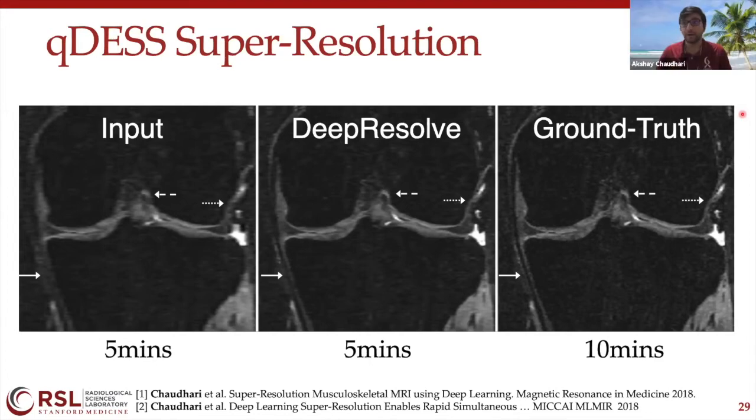Yeah, so I think when we train these algorithms, we try to account for some of these differences too. During our training, we can actually augment our training data set by creating new data that might be motion corrupted, because we understand the MRI physics interpretation of these models. So we can create from a normal data set what a motion corrupted data set might look like. In that manner, we can build up these nice data augmentation steps.